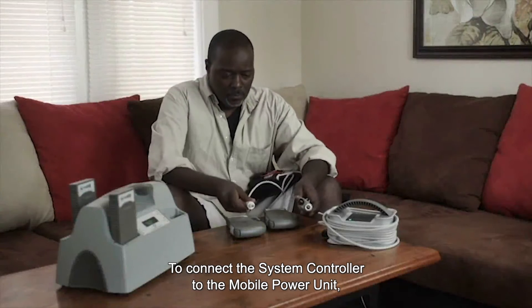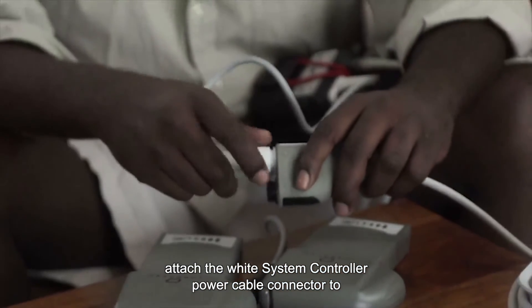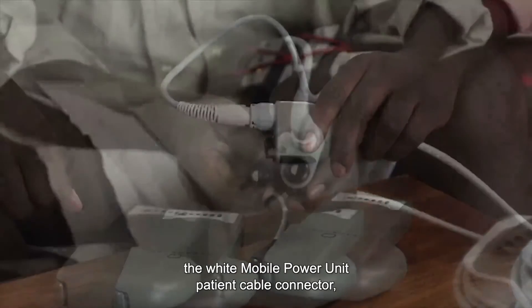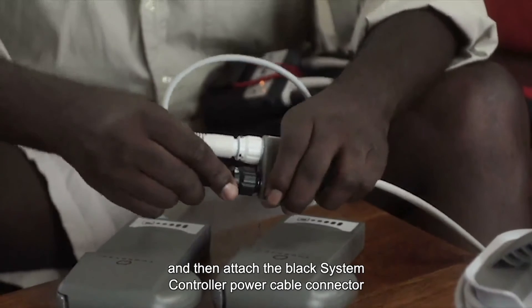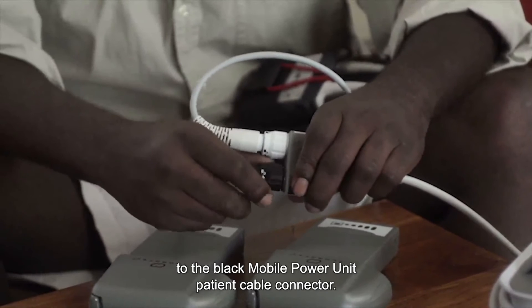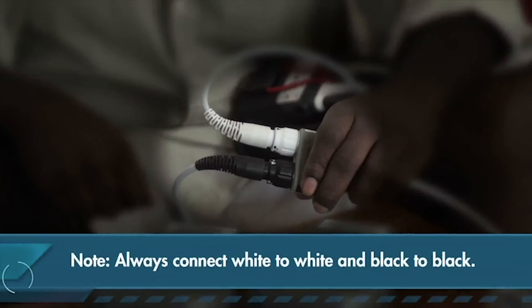To connect the system controller to the mobile power unit, attach the white system controller power cable connector to the white mobile power unit patient cable connector, and then attach the black system controller power cable connector to the black mobile power unit patient cable connector. Always connect white to white and black to black.